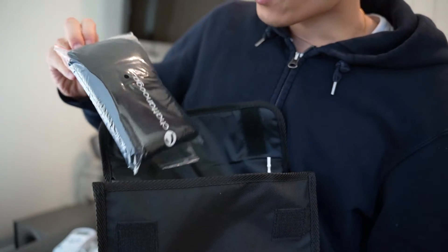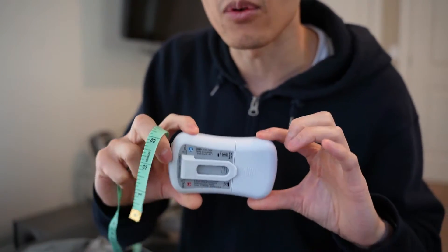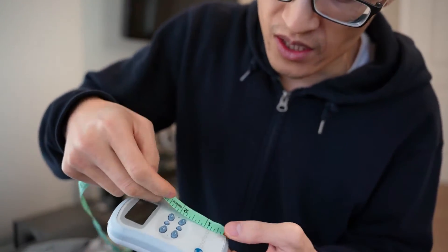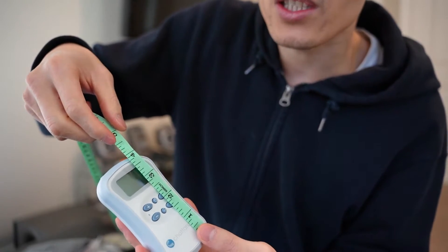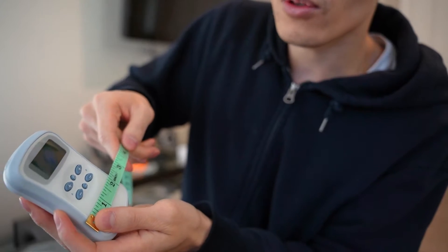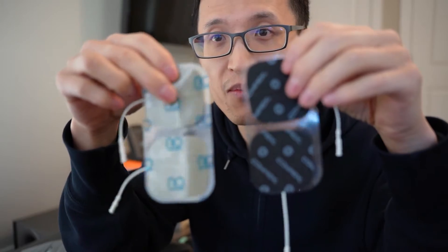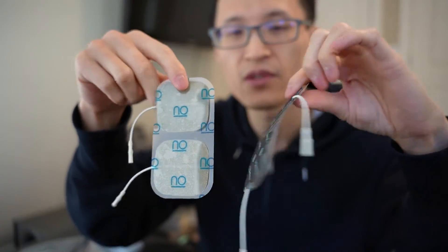It looks like you have a little baggie. This device has 8 TENS program settings and 6 NMES program settings. The device is very small and convenient for portability — it is about 4 inches in length, 2 and a quarter inches wide, and the thickness is less than 1 inch. The pads that it comes with have a good adhesive to them.